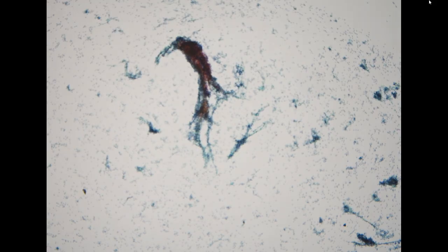But it is difficult to use the PARIS system here. We don't use the PARIS system terminology. We still report the cases as negative, atypical, suspicious, or positive. So this one we will call atypical, but we will make a note that there are monotonous urothelial cells and that we cannot exclude low-grade urothelial neoplasm.